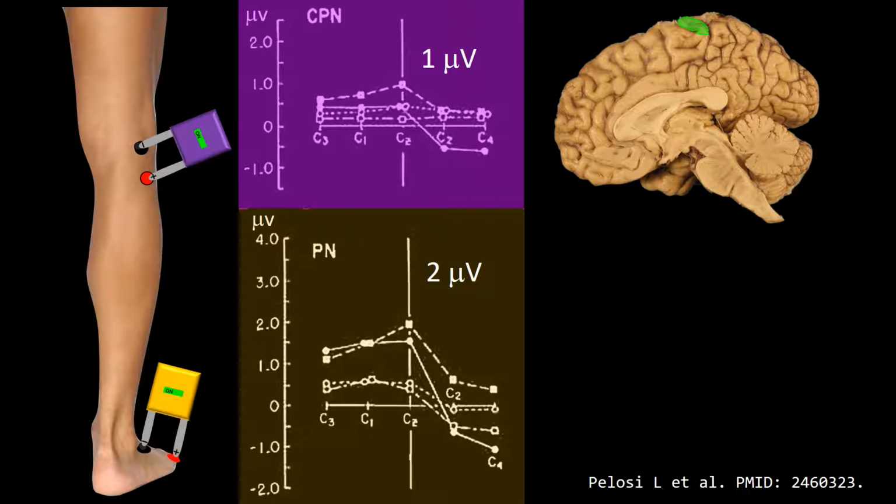This paradoxical situation, where a smaller number of stimulated fibers produce a larger scalp field than the stimulation of a larger number of fibers, is the result of cerebral anatomy at the level of the mesial surface of the posterior paracentral gyrus. At least this is what we believe. We think that the proximal stimulation, that is a stimulation at the level of the popliteal fossa, produces fields in multiple directions that cancel each other out, as I have attempted to demonstrate in this frame by representing green arrows going in multiple directions.